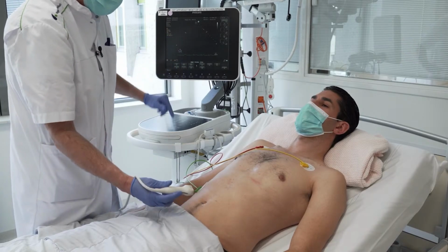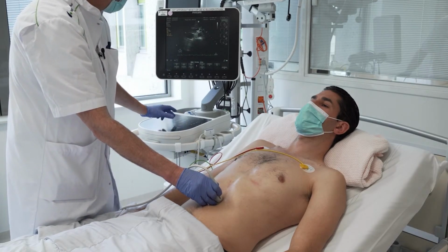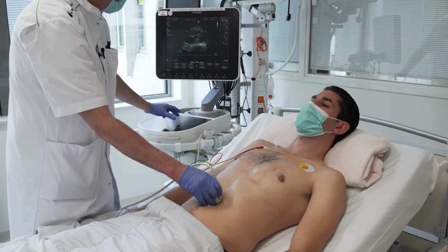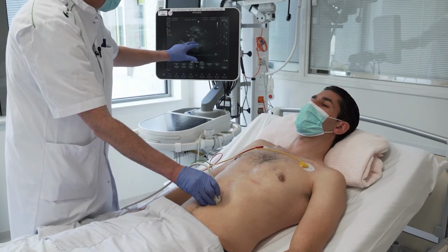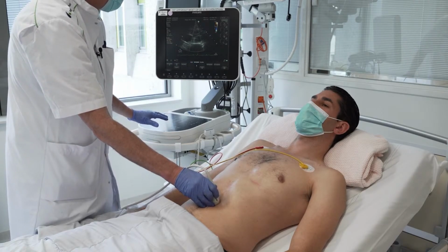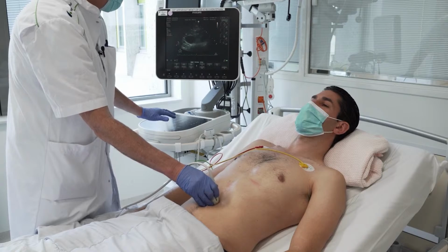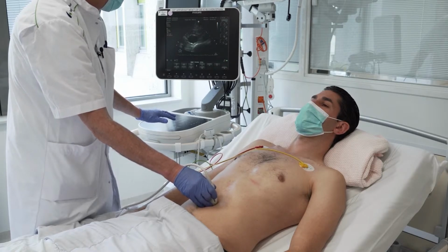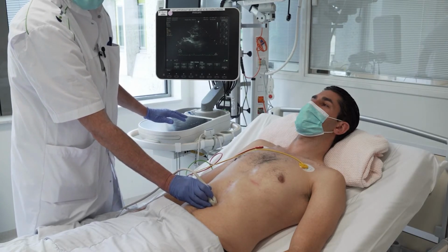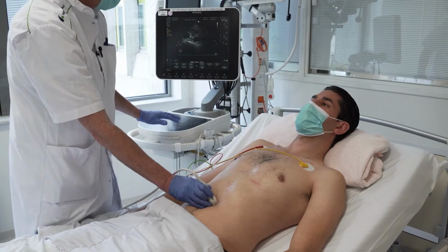From here we can go to the upper abdomen, and we are looking now for the aorta. I'm playing with my depth again, and I think we have the aorta here. Sometimes I'm not sure, and then I put in a color Doppler. Yeah, I think that's the aorta. And if you have a traumatic dissection or aneurysm, you will see it on the echo, and we can show pictures of those in the PowerPoint later on.